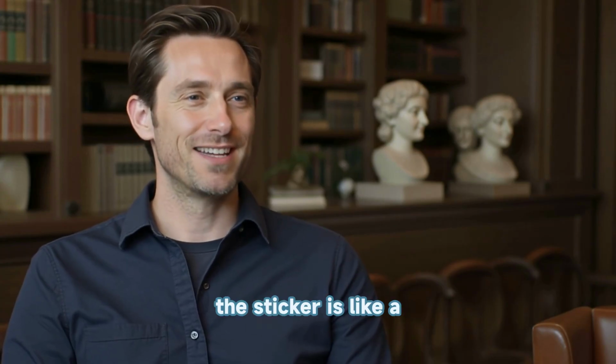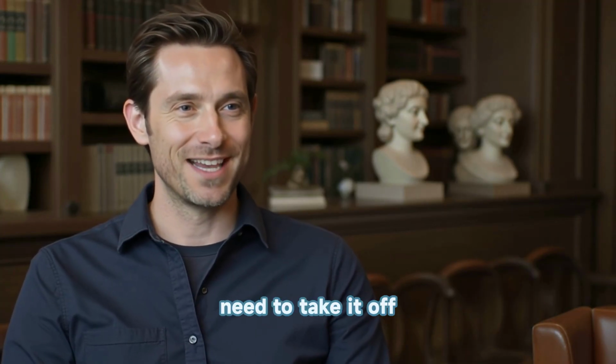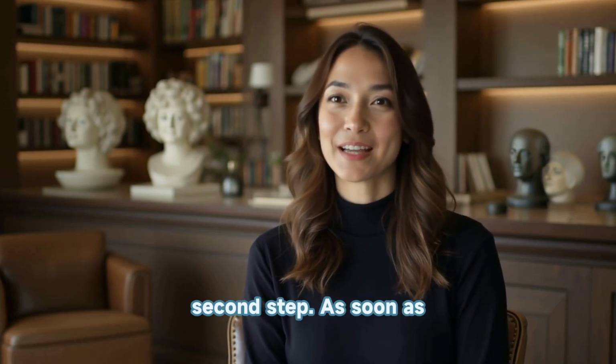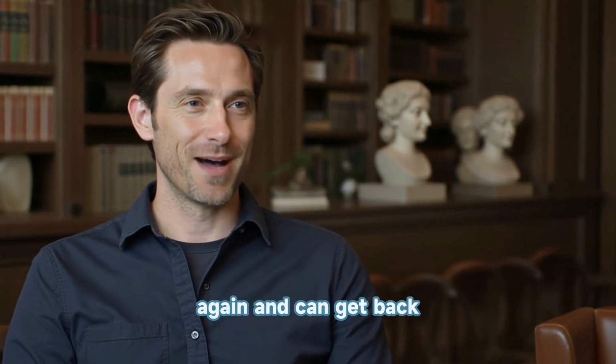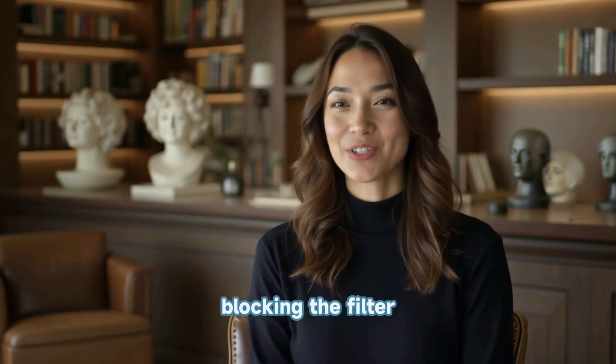So the sticker is like a temporary waterproof shield. Exactly. You put it on just before you get in the shower or pool to protect the filter. And then, presumably, you need to take it off again afterwards. Yes. That's the crucial second step. As soon as you're done with the water, and ideally once the bag surface is dry, you peel that sticker right off. So the filter is exposed again and can get back to doing its job. Precisely. If you leave the sticker on, you're blocking the filter yourself.